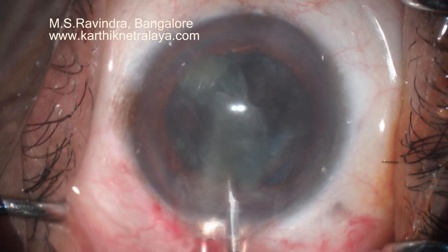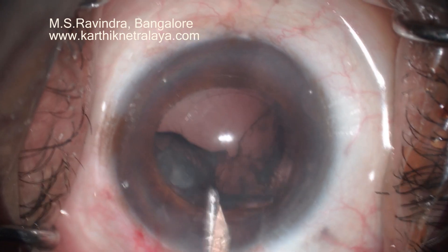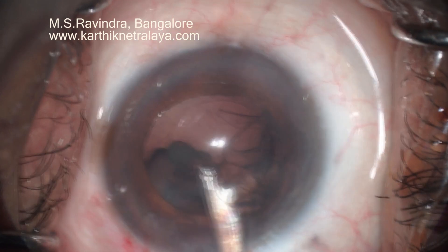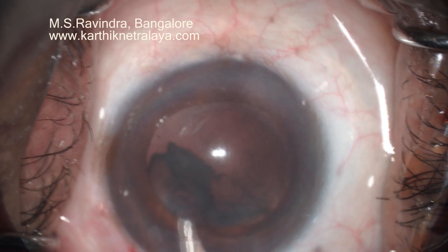I am now using a different kind of wire vectis, which is very slim and narrow — I call it the narrow vectis — and that is ideally suited to remove the heminucleus out of the anterior chamber without endangering the endothelium. The viscoelastic is continuously being injected in front of the moving nucleus so that the endothelium is maximally protected.